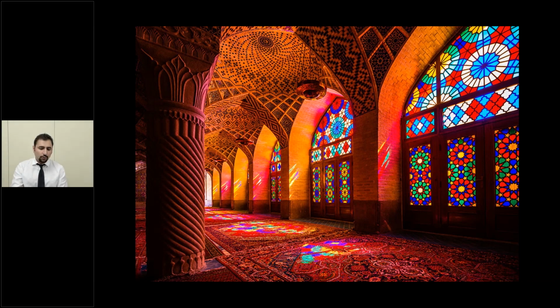Right. So it's traditionally done, right? And if the lab is in-house, not far away, there's no big deal about it. But if the crown is going to stay in the lab for a while, it's going to absorb all the dust, and then the clinician is going to see the patient 2-3 weeks after receiving the crown. So possibly it's better to recommend to the dentist, hey, I etched it a couple weeks ago. Now that you want to bond it, it's better you etch it again.